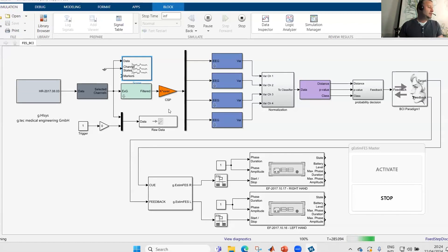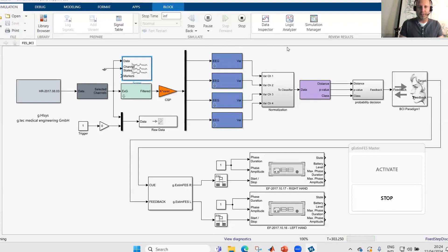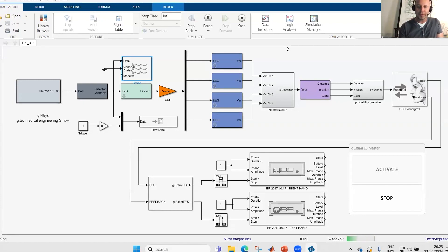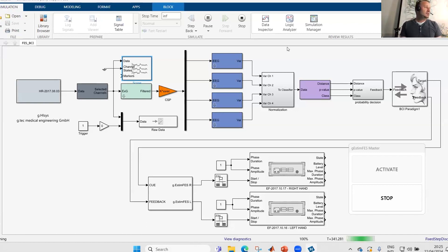We have now 28 trials already done. In total, this takes a bit because for each trial you need approximately around 10 seconds — a little bit more because you always have this onset with arrows popping up, and then you have this time to get the motor imagery done. During this imagination, you should always focus on the same movement and not switch. Sounds easy to think about a movement, but it's actually not that easy. Healthy people usually just do the movement — we are not imagining it. For some people it's an easy task, but for others it can take a little bit of training to get really good accuracy levels.